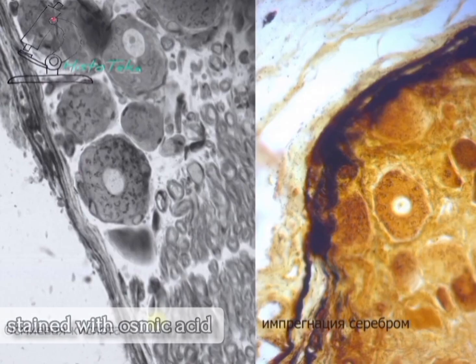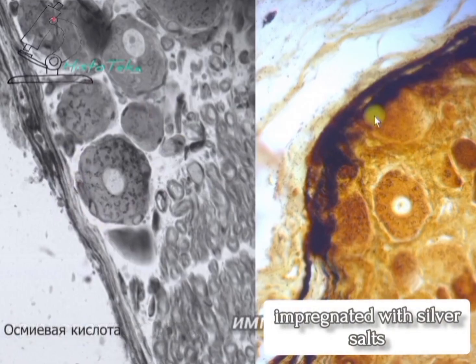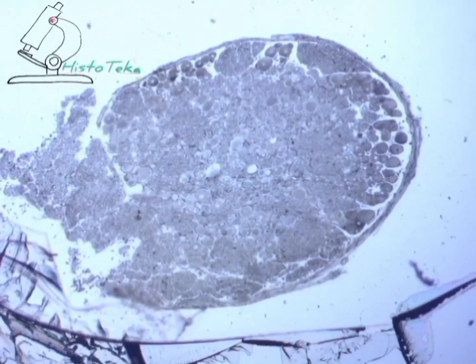In the case of osmic acid, the preparation is colored in various shades of gray. In the case of silver impregnation, the preparation is yellow-brown. Let's start with the preparation stained with osmic acid. Here you can see a low magnification of the spinal ganglion with clearly distinguishable bodies of neurons, that means nerve cells, in the center of which light rounded nuclei are visible.